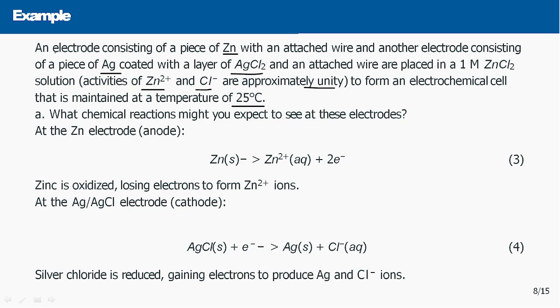The first question is, what chemical reaction might be expected at these electrodes?